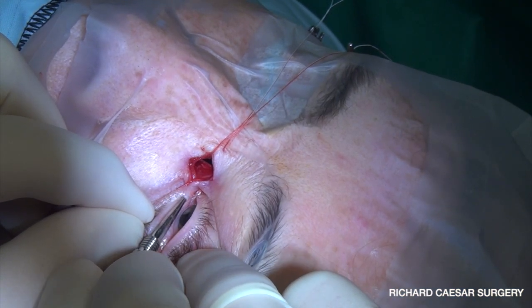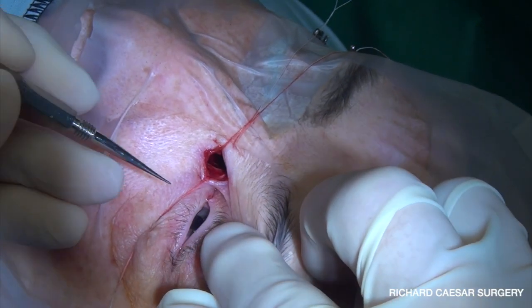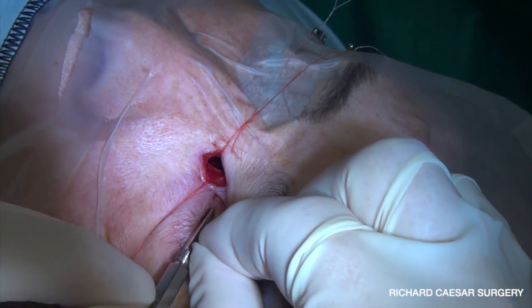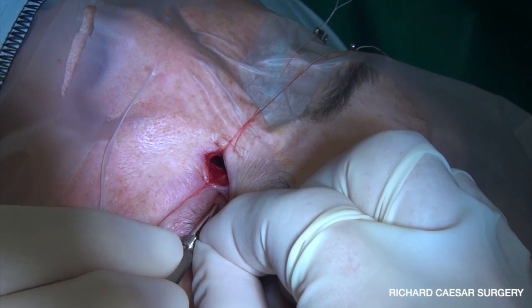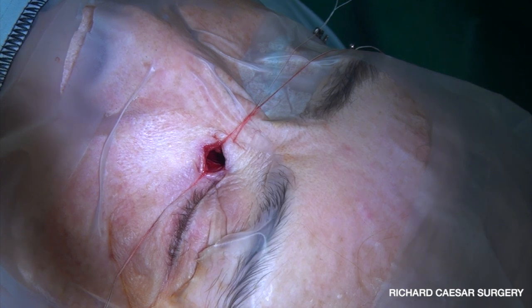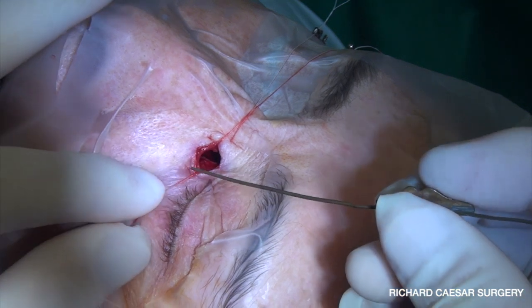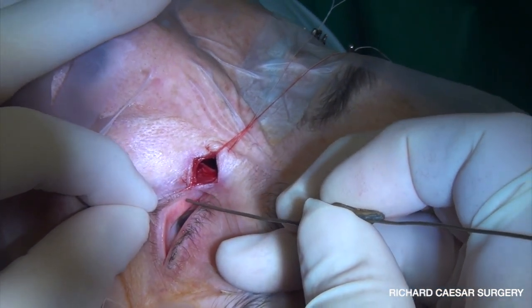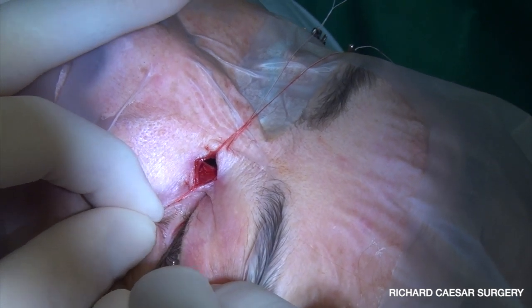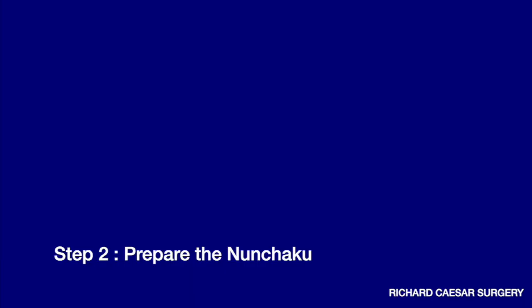With this kit, insertion is the same as normal. You would have a DCR prepared earlier and here you can see my DCR is ready to go. I've prepared the nasal space and I'm ready for my silicon intubation. Each of the puncta are dilated and you need to dilate enough to pass an O probe — this is then adequate for the Nunchaku. We're just confirming that this will pass fully and easily in between the nasal lacrimal flaps, and that works nicely.